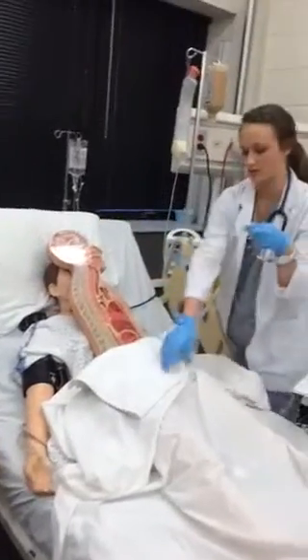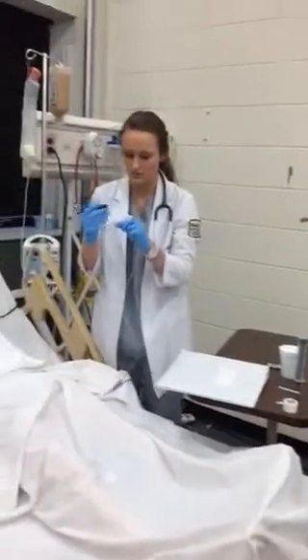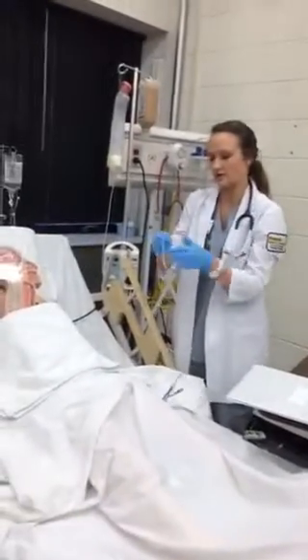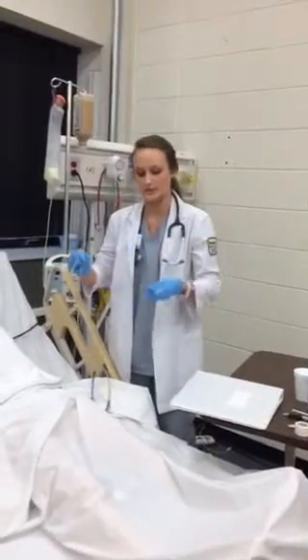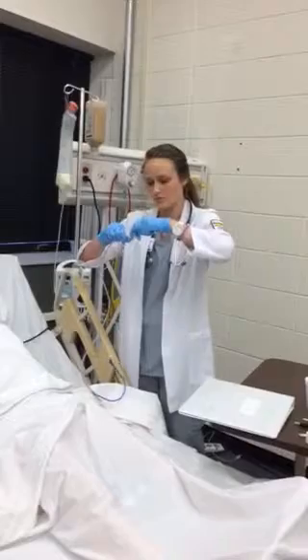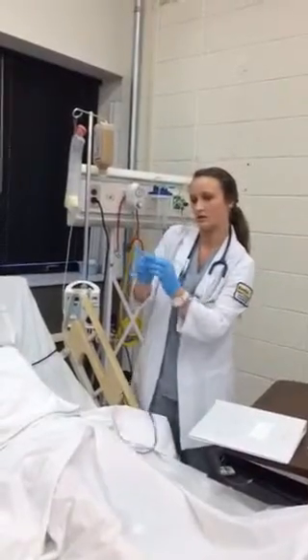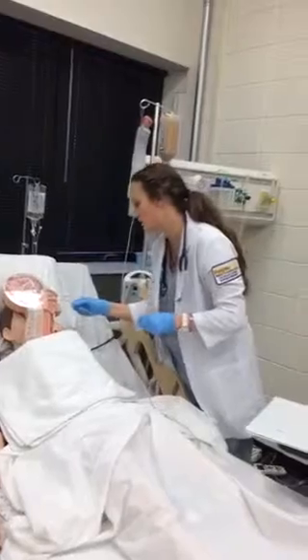And I'll mark this measurement so I know where to stop. And then I'll get my lubricant out, just so it goes down a little bit easier. Once it's lubricated, I can go ahead and insert the tube into the nose.